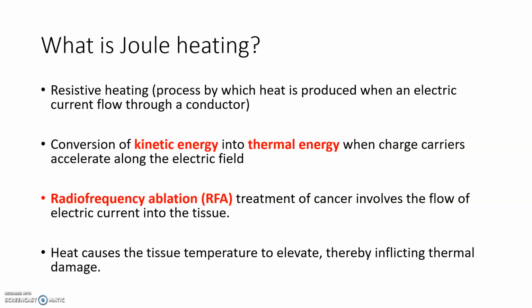In radiofrequency ablation, we apply the principle of Joule heating to destroy the cancer tissue. Basically, electric current is allowed to flow into the tissue, where the same resistive heating process will cause the tissue temperature to elevate, and when it elevates beyond a certain threshold, thermal damage is induced to destroy the cancer tissue.